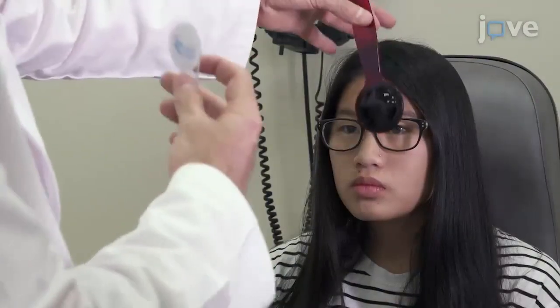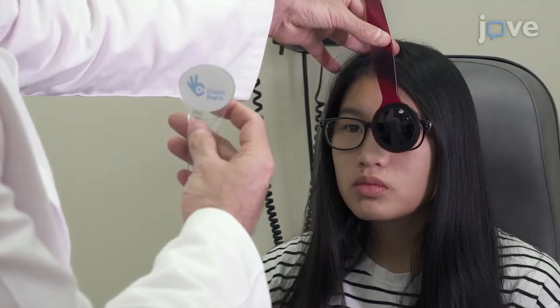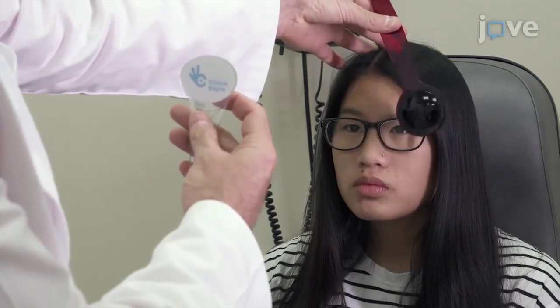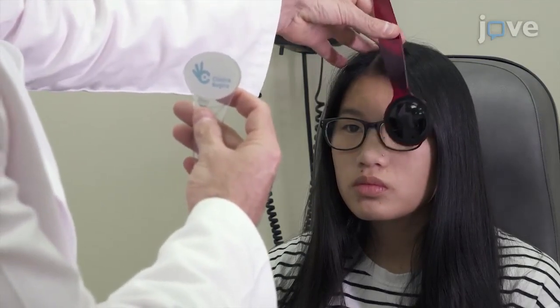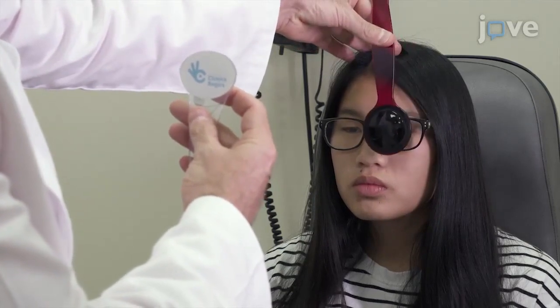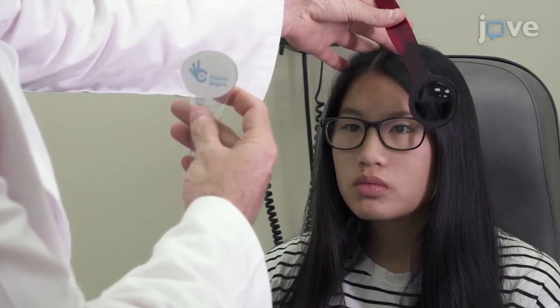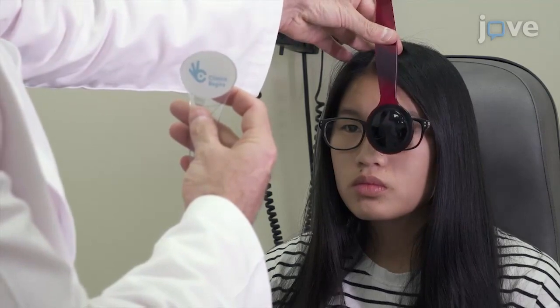To check for the absence of strabismus, use a monocular cover-uncover test and stimulate accommodation with a letter acuity score of 20/30, to ensure that the patient looks at the letter with the fovea when performing the fixing movement.